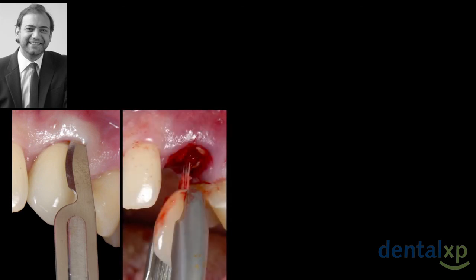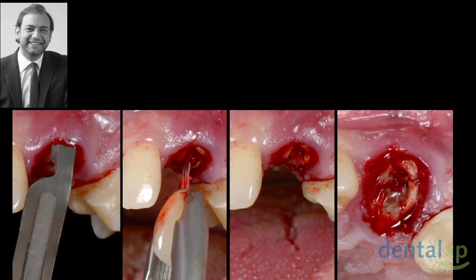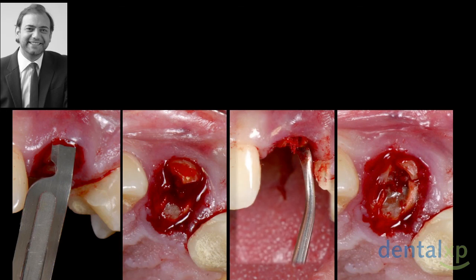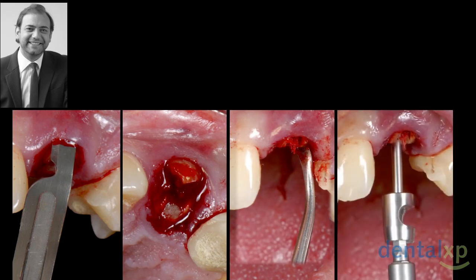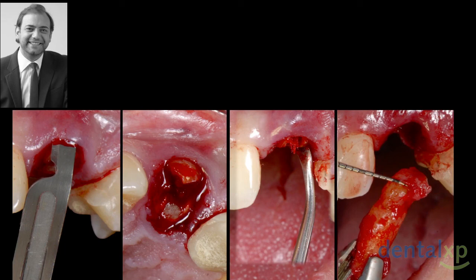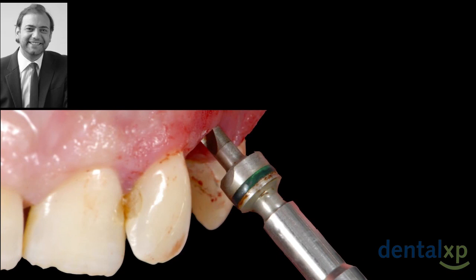15C blade, mobilize the tissue, remove the restoration, then go further and deeper. You see the fractured root. With the 15C blade, you can even use bendable blades, tunneling instruments to make your life easier. Extract the root. 2 minutes, David, I'm done. As you see here, the defect, no buccal plate. But we know from our CT scan that we have enough bone palatally.